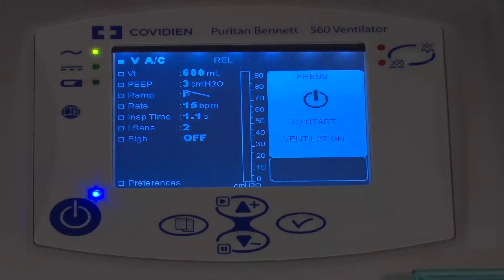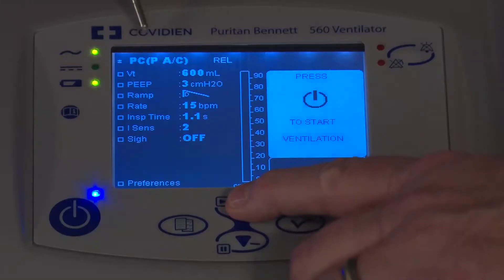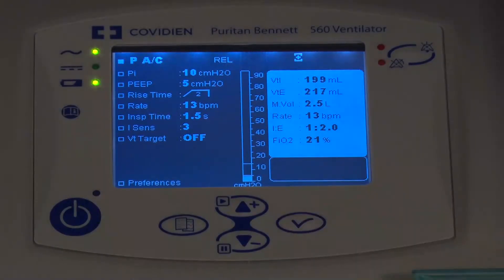Once I'm done with the secondary preference screen, I go down to back to ventilation and press accept. Now I'm going to change the mode of ventilation — I'll change to pressure control and press the check mark button to accept it. On this screen, the ventilator uses a relative pressure convention (REL), so if you have a pressure of 10 set and a PEEP of 5, it will go up to 15.